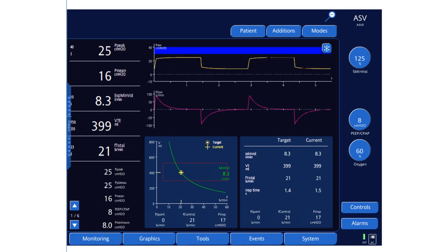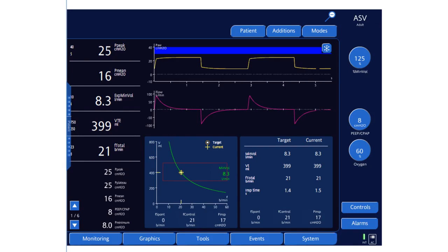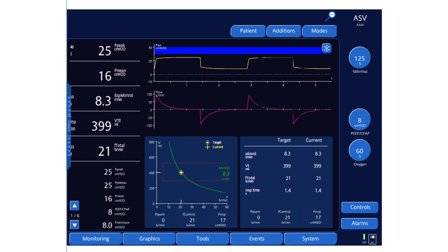Once the mode started, the machine gave five test breaths, calculated the expiratory time constant, and came up with an optimal respiratory rate of 20–21 for this patient. The target tidal volume is 399 ml. The machine drew a green curve representing all combinations of respiratory rate and tidal volume that deliver a fixed minute ventilation of 8.3 liters per minute.